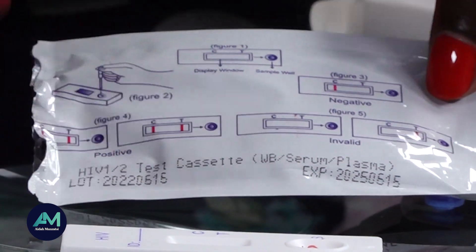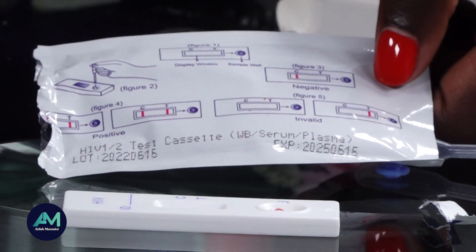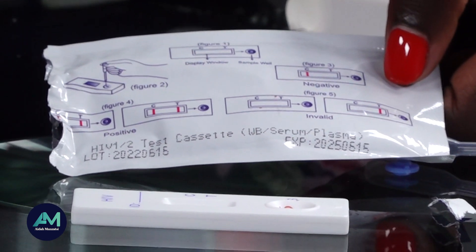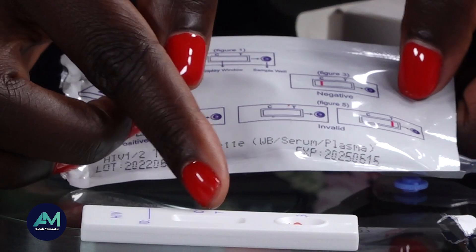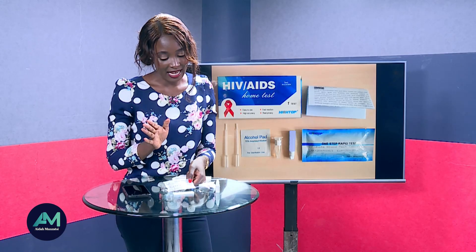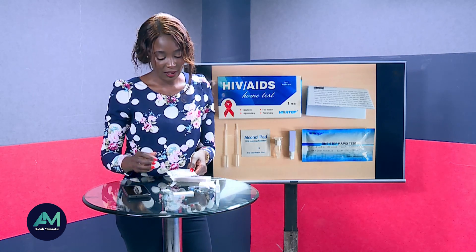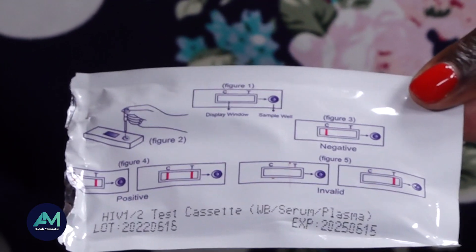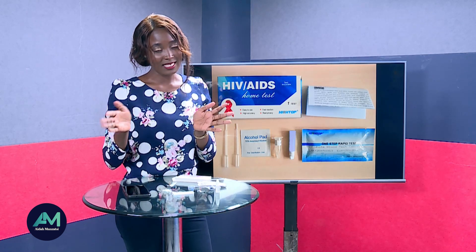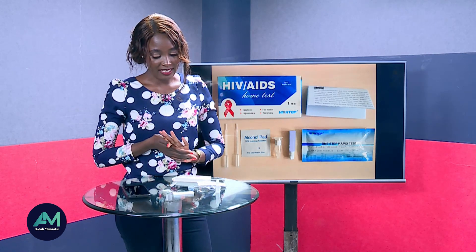If one line shows at C, that means you are HIV negative. If two lines show — at C and at the T testing area — that means you are positive. If one line shows only at T, that is an invalid result. If there is no line at all, that also means the results are invalid. The instruction paper included will help you interpret the results.